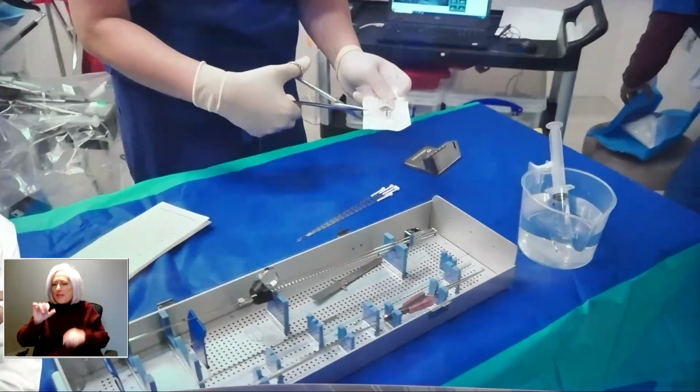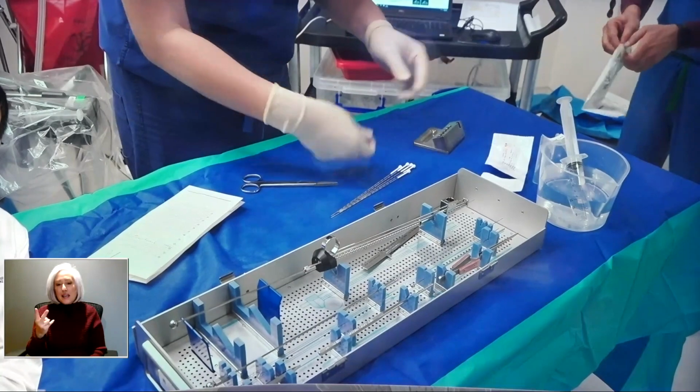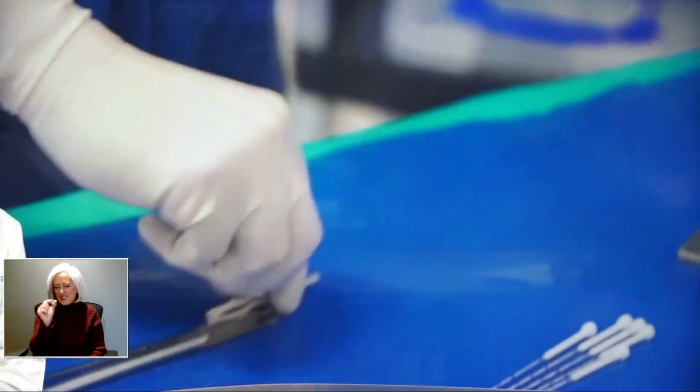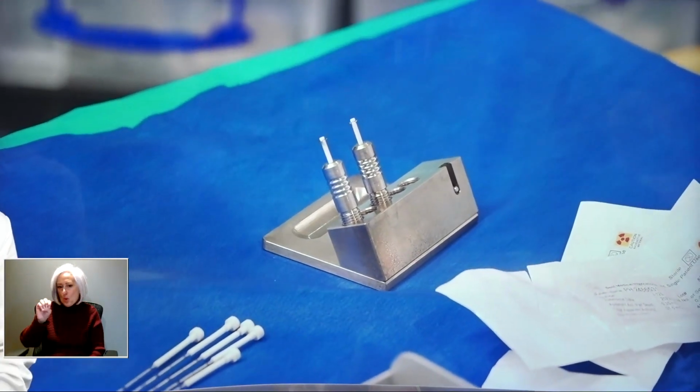And what you saw in the video is cartridges, and you'll see it again. You'll see cartridges, and each cartridge contains about 15 tiny little seeds. They're probably the size of a grain of rice, but maybe half the thickness. And I think the thickness is a little bit like mechanical pencil lead for people who used to use mechanical pencils. It kind of looks like the lead, but very short. So very, very little seeds that deliver radiation that we're able to put inside the prostate.